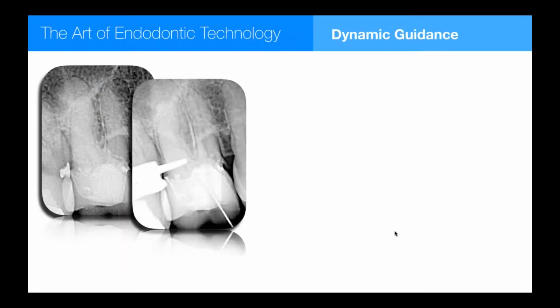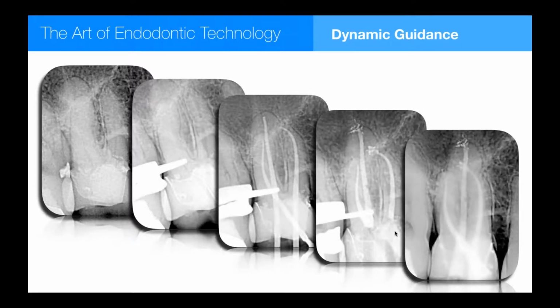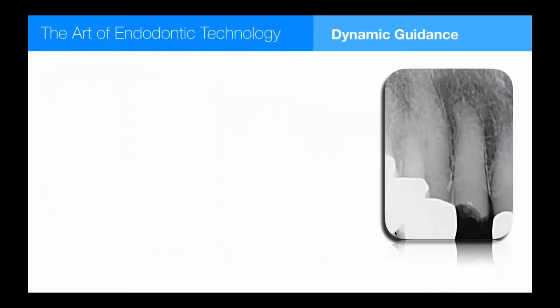Here's another one, 3 separate openings. You can see individual pathways for each canal. And that's eminently doable. And you could argue that this tooth has actually no loss of structural integrity because we're making these separate holes. It's kind of like putting holes in the rib in a fuselage of an airplane. You can cut the holes in the right place and lose a lot of weight and no strength. So we may be able to do root canals in the near future without weakening them one iota.